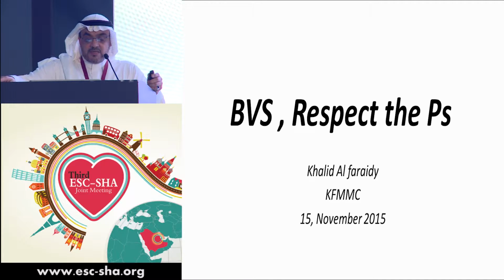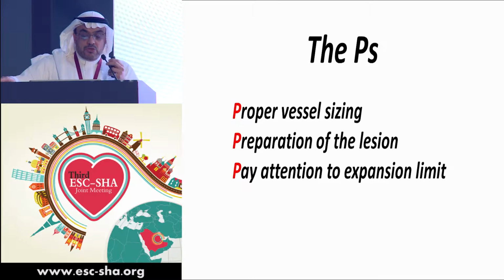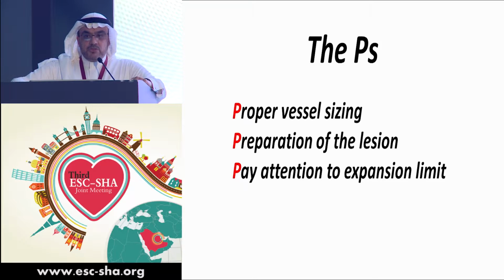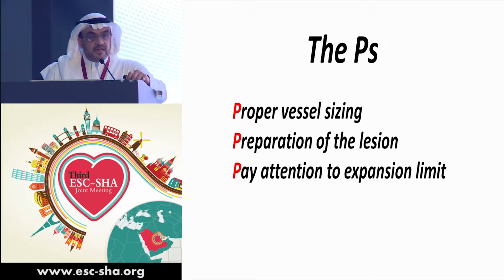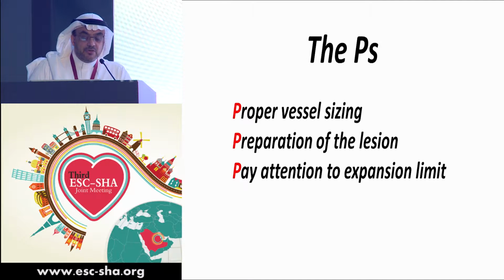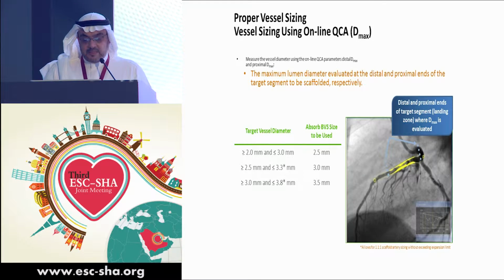So my cases, I called it respect the P's. When we want to use BVS, I think we have to respect these P's: the proper vessel sizing, the preparation of the lesion, and paying attention to the expansion limit. And I'm going to talk about that in detail here.